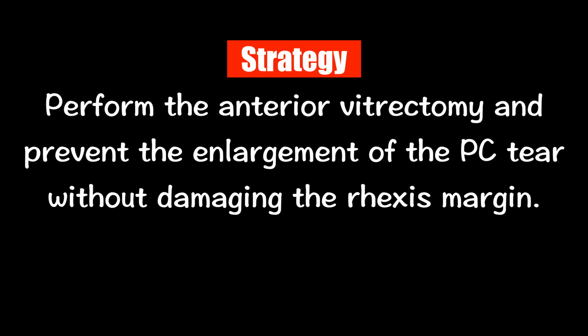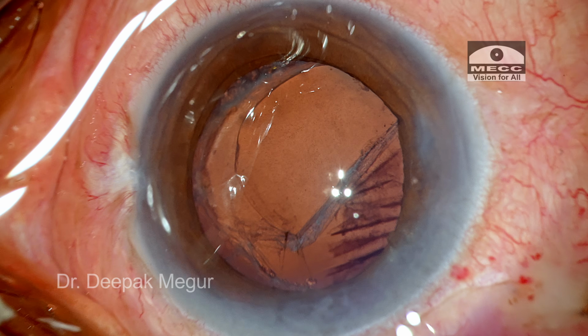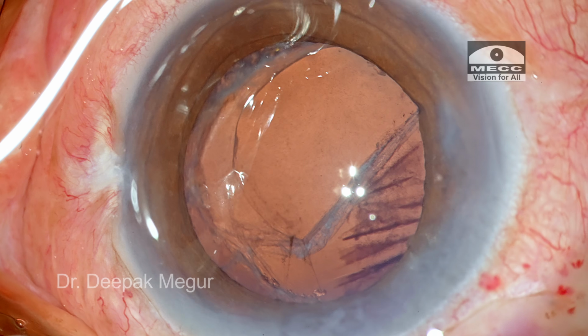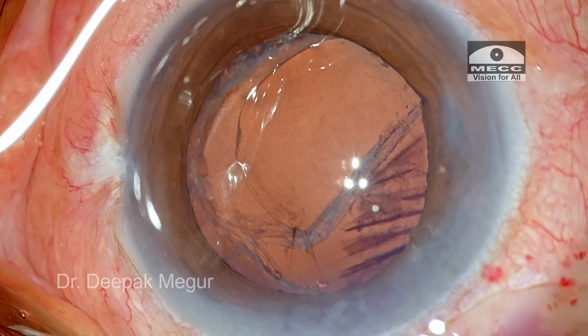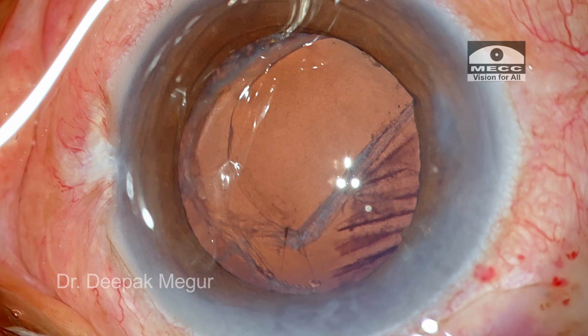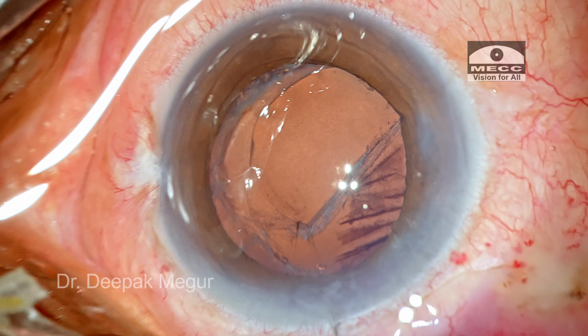So my strategy is to do anterior vitrectomy and try to prevent any enlargement of the posterior capsular tear and damage to the rhexis margin. Then the posterior chamber lens placement in the sulcus is a distinct possibility. The surgery is almost 10 days old now, and you can see that the margins of the posterior capsular tear are thickened. And that's a good sign that during intraocular maneuvering or during anterior vitrectomy, it's unlikely that the posterior capsular tear is going to enlarge, and this would be beneficial.